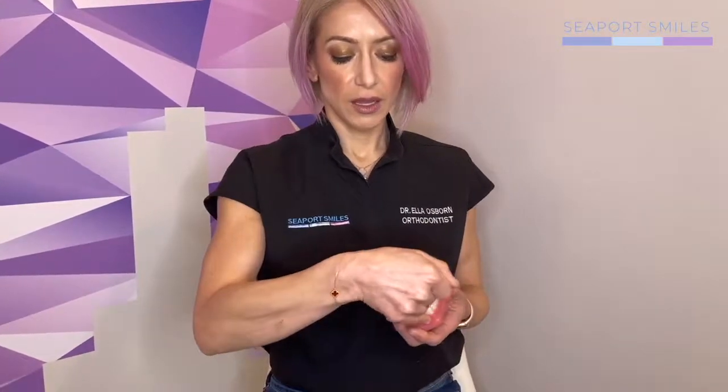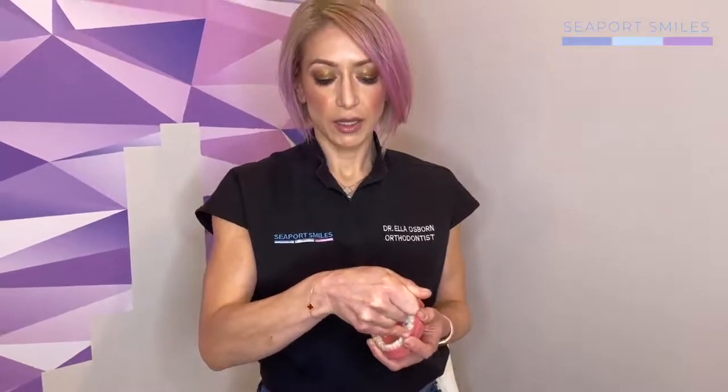How to take your aligners in and out: aligners at first can be a little tight, so we provide you with a special little hook tool that helps, which is very useful at first. When you are going to remove your aligners, you want to start on the inside in the back, hook and pull up a little and away from your teeth, pulling away from the attachments and across until it's removed. To put your aligners back in, you want to do the opposite — start in the front, push down, and then work your way backwards.